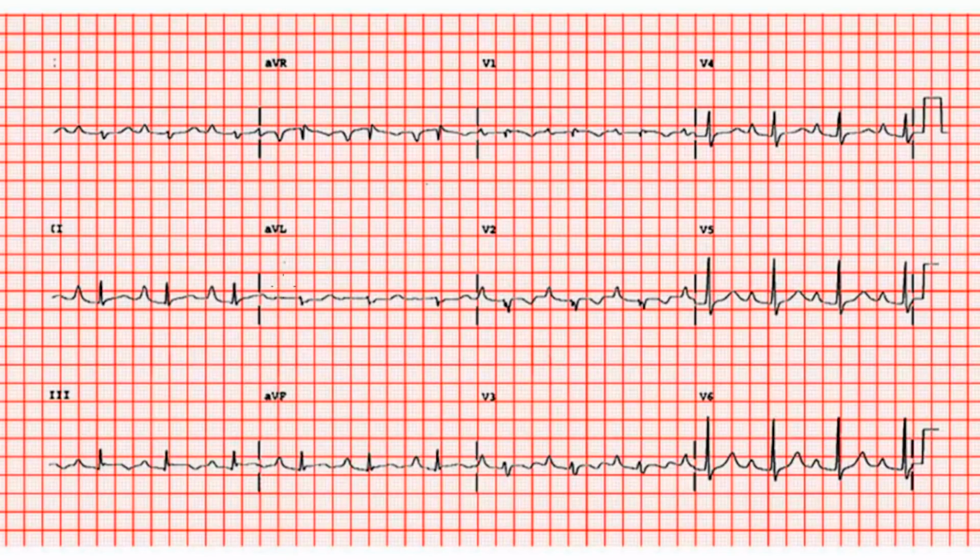Okay, so let's take a look at an example here of an EKG. Let's take a look here at lead 2, which is probably the best lead to see P waves. You can see clearly there's a P wave right there, and here, there's a QRS complex. If we measure the distance from the beginning of the P wave, which begins right there, to the beginning of the QRS complex, which is right there, clearly we can see that that distance is bigger than one large box.